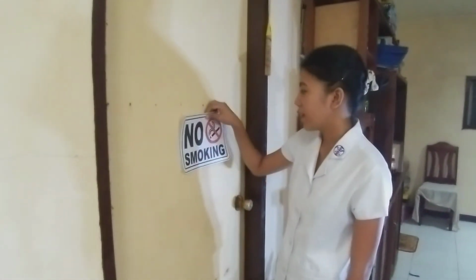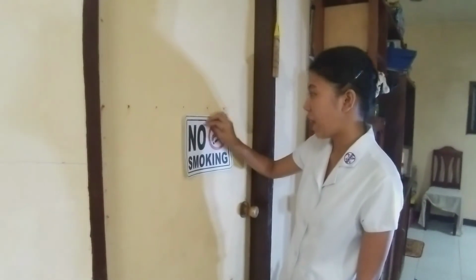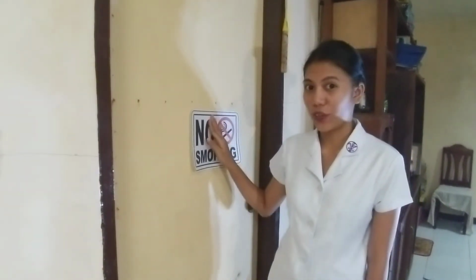So next is to perform a respiratory assessment to develop baseline data if not already available. This is to obtain baseline data that we can compare later on to see if there are any improvements to our patient's condition. Since we have done this earlier, I will now proceed. Before proceeding to the client's room, we should first post here the warning sign that I will be going to explain later on.